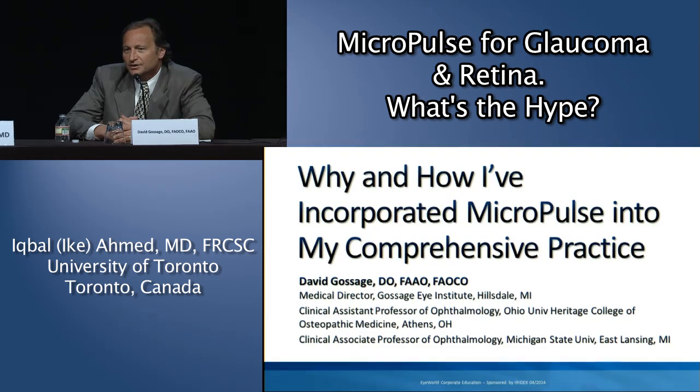Looking at the electron microscope slides that you showed and demonstrated, we know at 1,000 milliwatts of power that we're not seeing any damage to the trabecular meshwork. The problem is doing cadaver slides these days is a little bit harder, and so higher than 1,000 milliwatts I probably would avoid at this point. I've seen no postoperative inflammation at all.